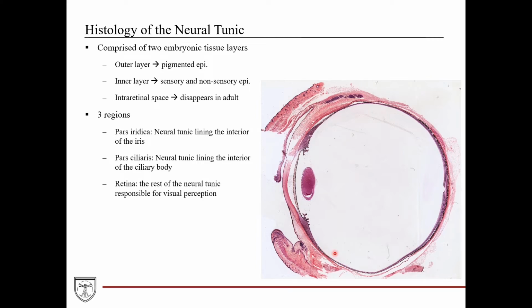And this boundary between the retina and pars ciliaris is anatomically called the ora serrata. And this is because when we look at the globe from the posterior aspect, from the inner aspect, what we see in 3D is almost a serrated outline between the retina and pars ciliaris that goes all the way around, hence the name ora serrata. And this anatomical landmark occurs due to the histological thinning, if you will, of that retinal layer from multiple cell layers to just a two-layered stratified cuboidal epithelium.